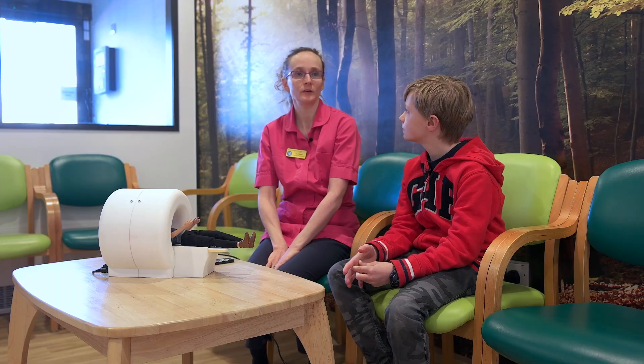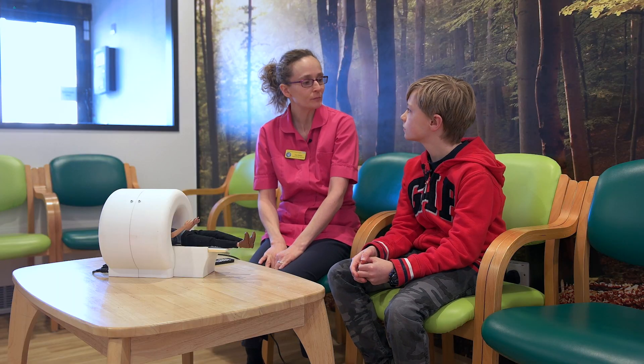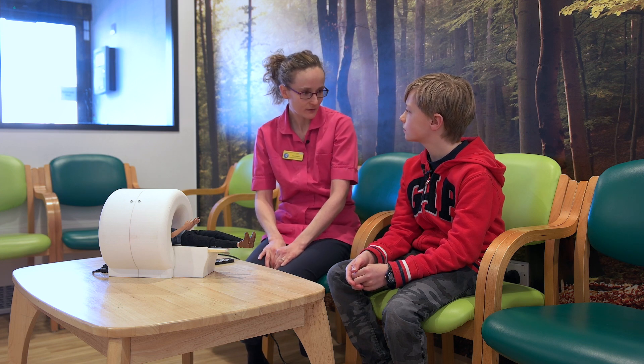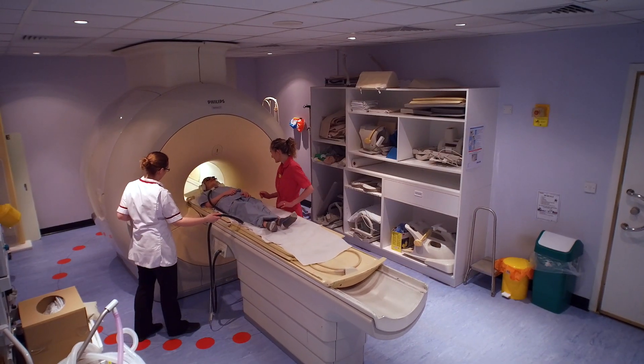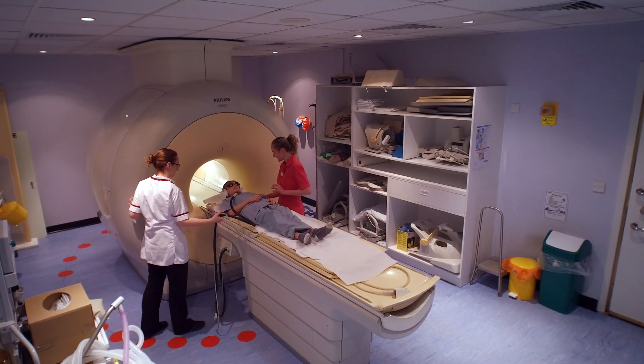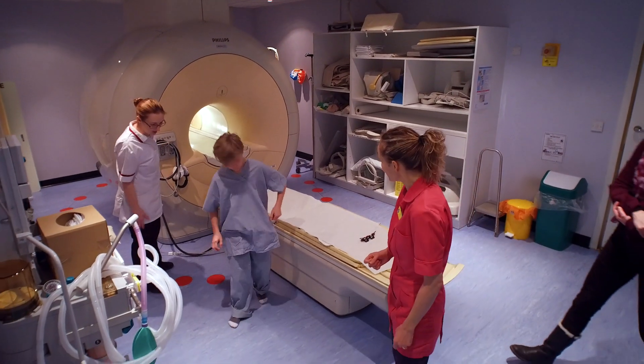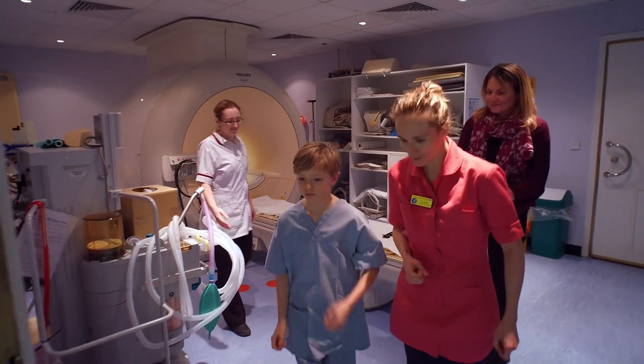How long do I have to lie in there? A spinal scan takes around about 30 minutes. Can I wear my own clothes in the scanner? You can wear your own clothes as long as they haven't got any zips or metal, but normally we'll probably give you some of our special pyjamas to wear. Just remember, it is just noise — it isn't painful. And in fact, some children fall asleep in there too.